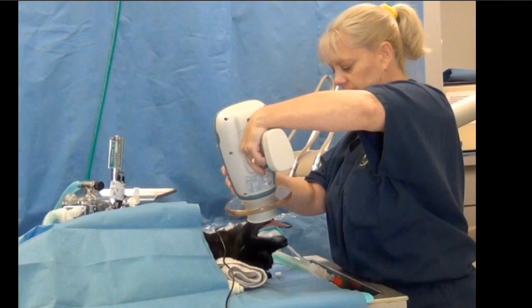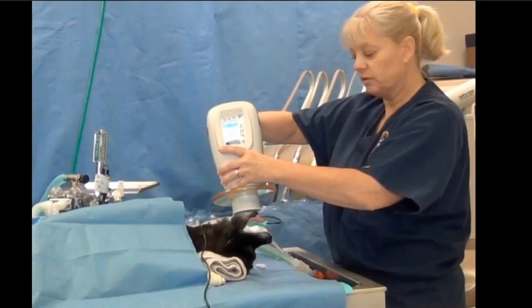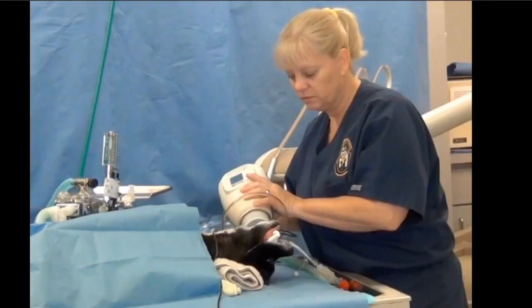Then the next shot follows, then about 70 degrees, and then parallel back on that other side. So that covers every single patient. That takes Annie about four minutes to go through the whole patient. You should be taking full mouth radiographs on small dogs in eight minutes or less. If you're not, you're probably not using this method — or if you are, you need to practice more, because it is totally doable to do a small dog in eight minutes or less.